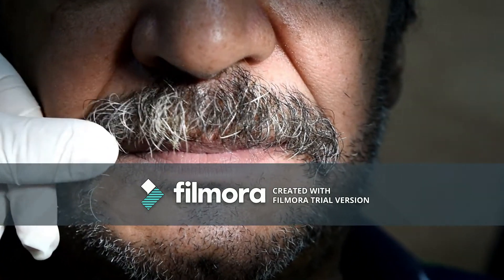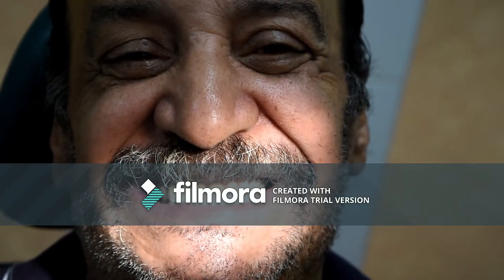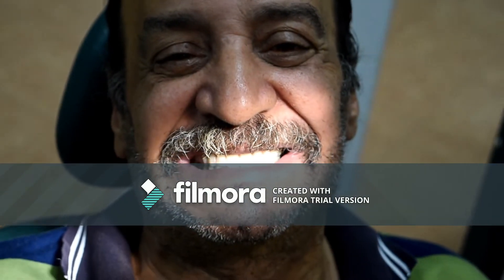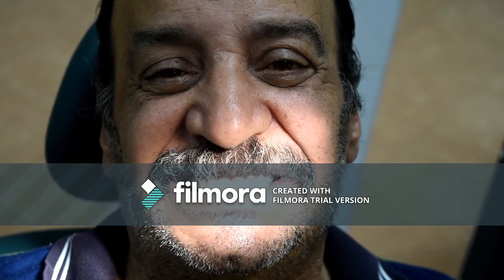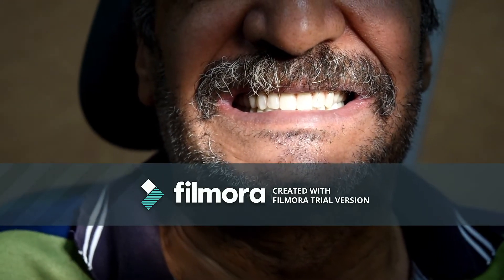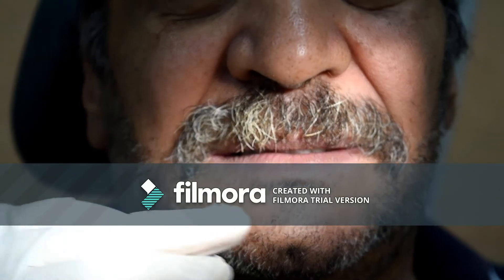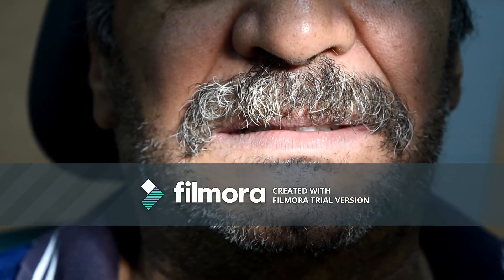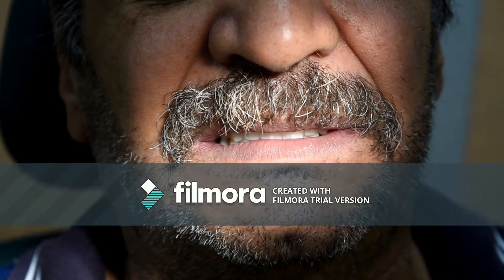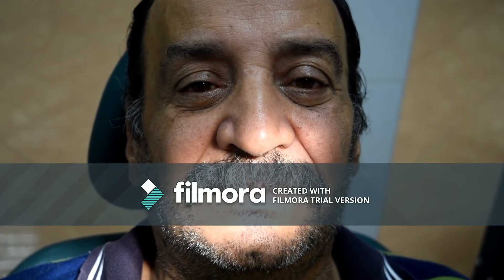After that, ask your patient to smile. The shape, shade, and size of the teeth should be checked. Regarding shade, it should conform with the patient's age — for older patients, darker teeth can be chosen. It should also conform with the shade of the skin, eyes, and hair. Regarding size, the mesiолabial aspect of the canine should be visible from the front, and the tip of the canine should align with the corners of the mouth. Regarding shape, it should conform with the shape of the patient's face — a rounded face requires rounded teeth, and a long narrow face requires long narrow teeth.